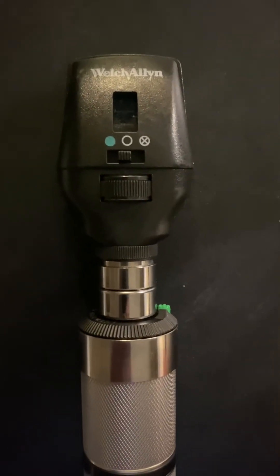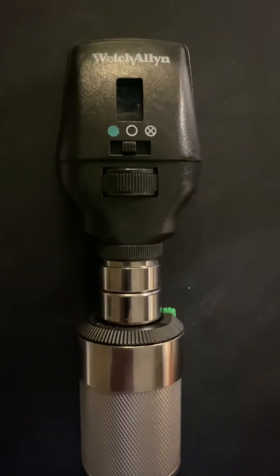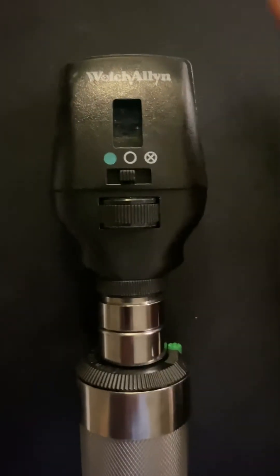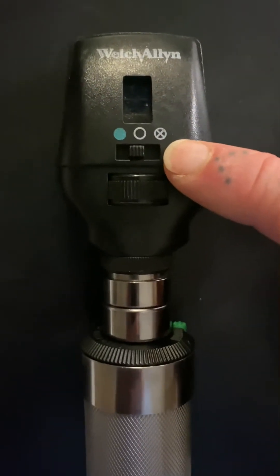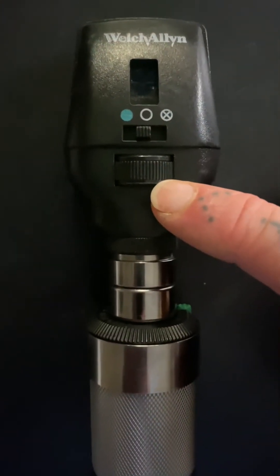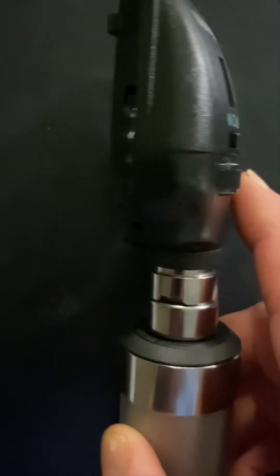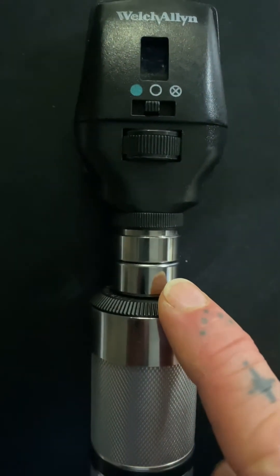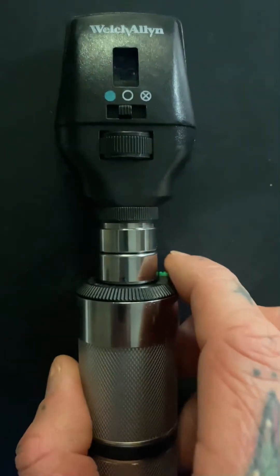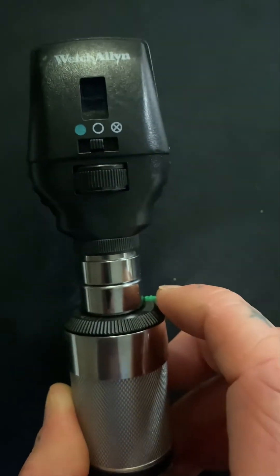This is just a little bit of information on the actual ophthalmoscope and what the different areas are. This area up here is the viewing window, this is the filter switch, this is the aperture dial, and the sides here are the diopter dials — they're on both sides. And this is the rheostat, which is what we use to actually turn the light on and off, controlling the intensity.